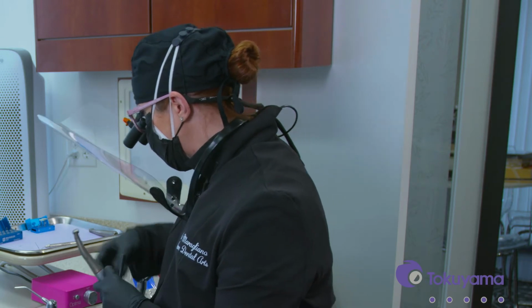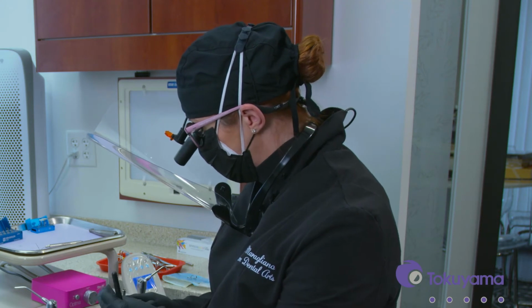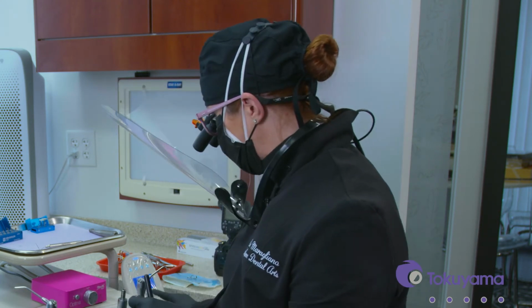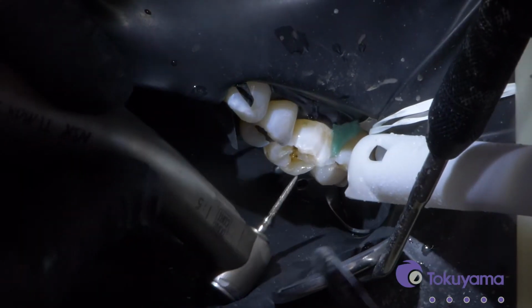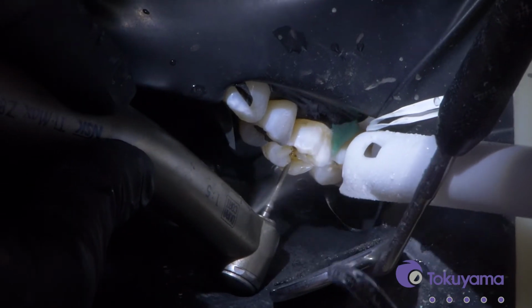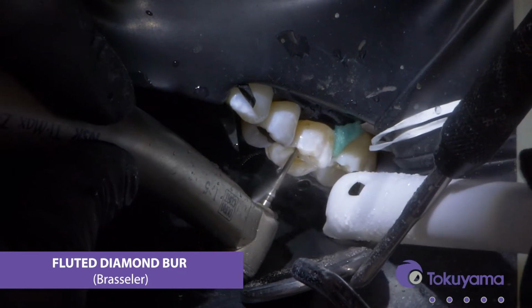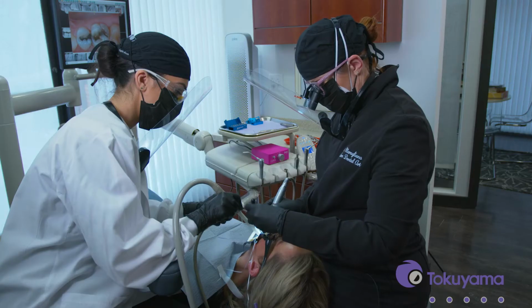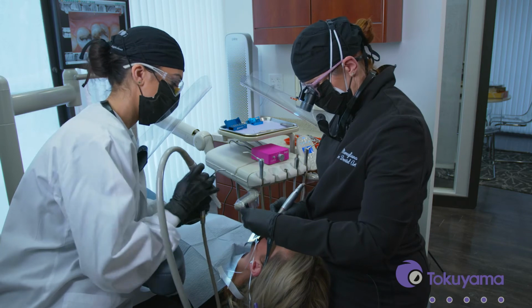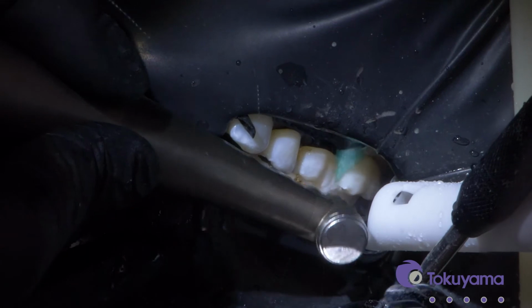To bevel, I like to use a nice fluted diamond burr. And again, I have a few different shapes and I just use what adapts best to the tooth. You okay, Sarah? Mm-hmm. Okay. And we're ready to restore.